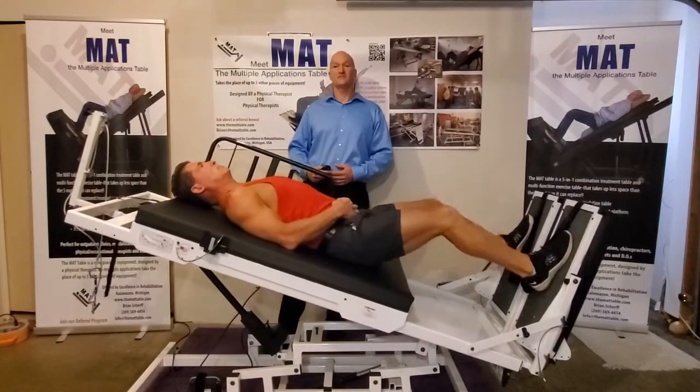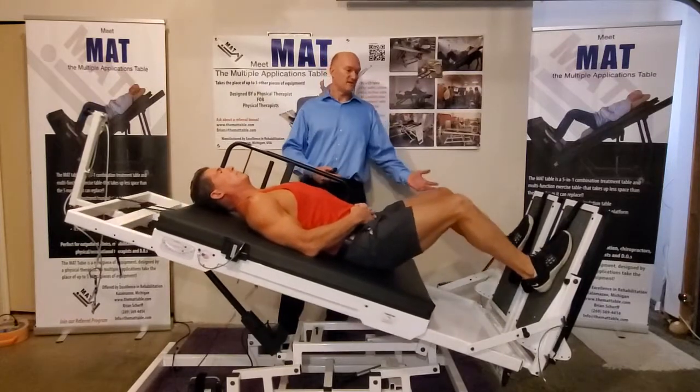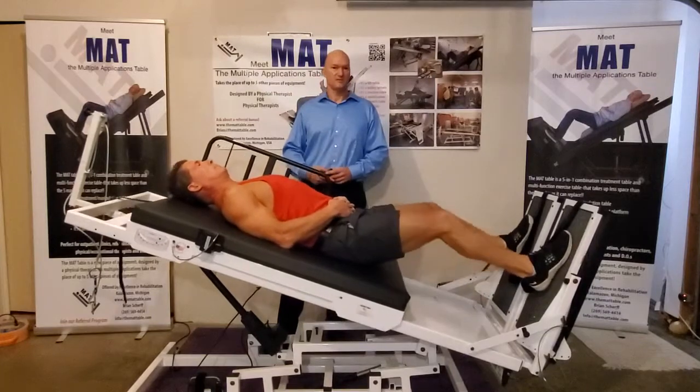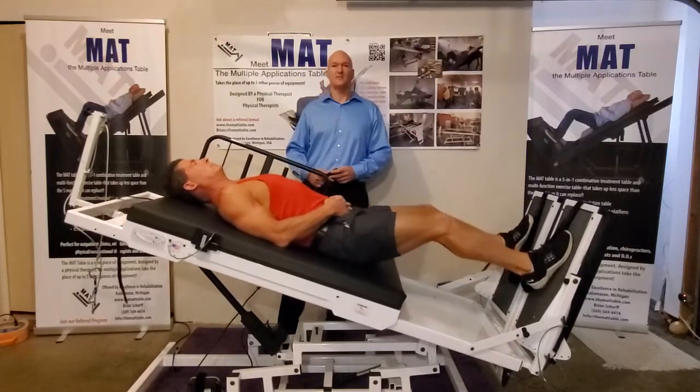And that's how you convert from a table to an exercise inclined squat machine. The Multiple Applications Table — the MAT, M-A-T. Thank you.